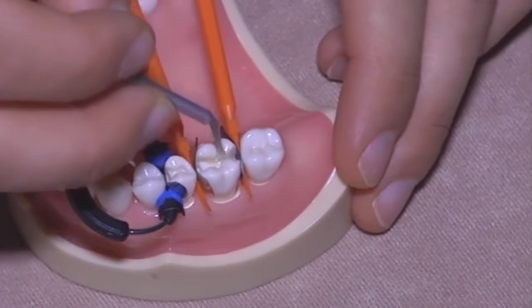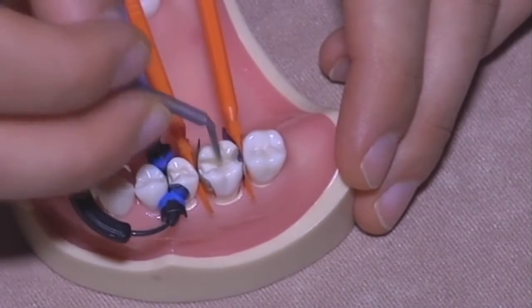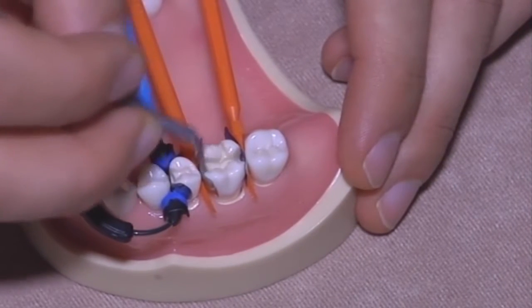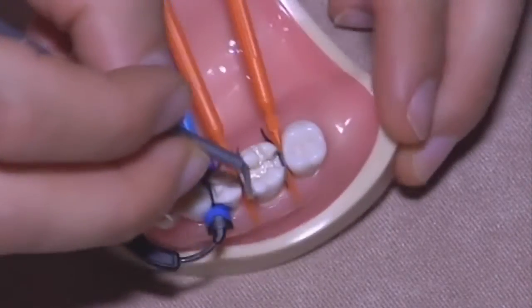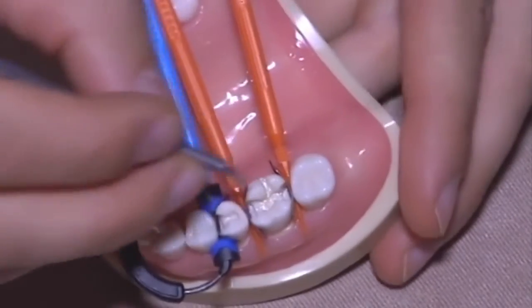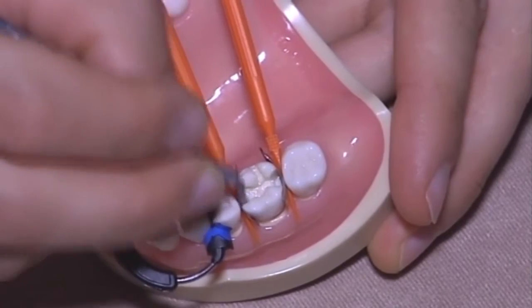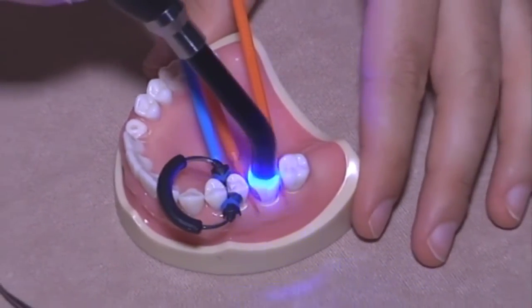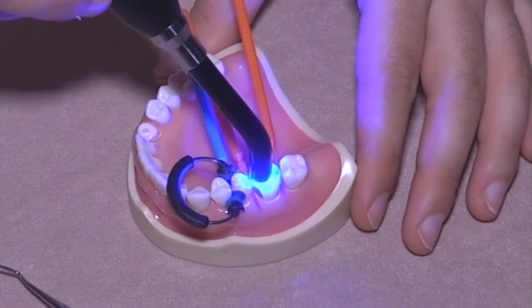And here the procedure is the same, so be precise and meticulous in applying a lot of bonding agent everywhere. Blow again and then brush it again. We saw the procedure, and light cure at least 20 seconds. Okay.